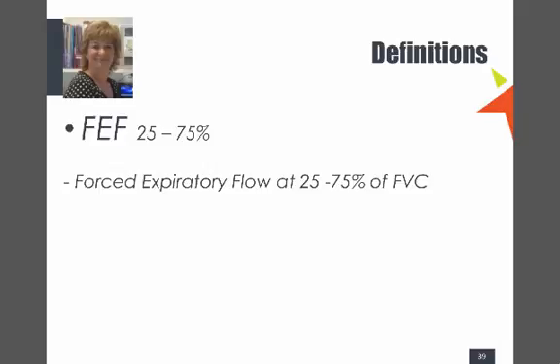And then we've got this forced expiratory flow. You don't need to worry about this very much, but it is interesting to see that sometimes on spirometry, and I'll show you on some of them, that you might have an FEV1 that's relatively normal, an FVC that's relatively normal, but your small airway flow is down. What this means is the flow of air that can come out as the airways get smaller to the bottom, it's saying that the ones at the bottom are starting to narrow.